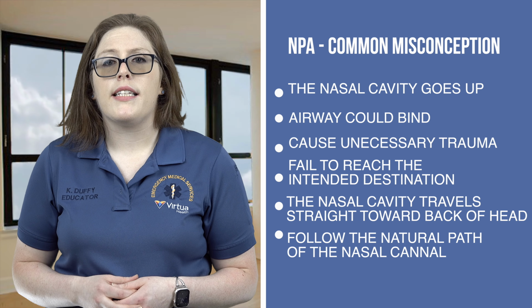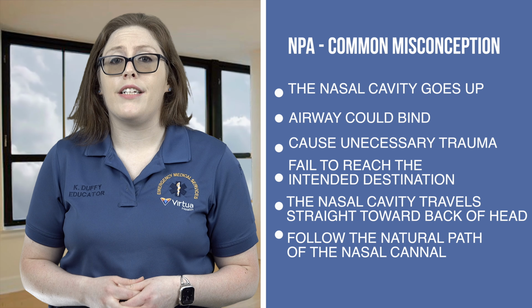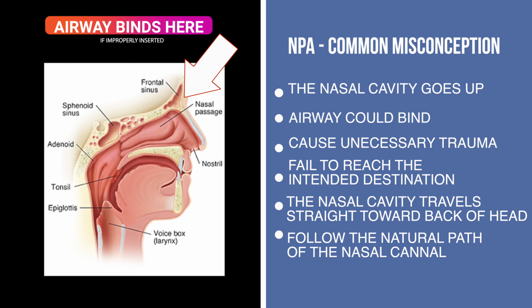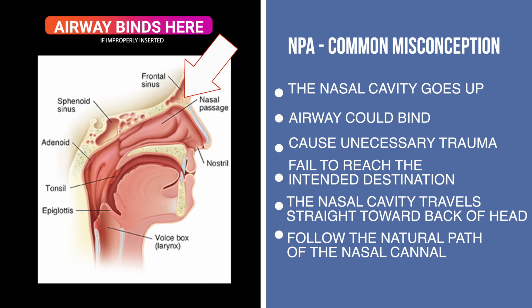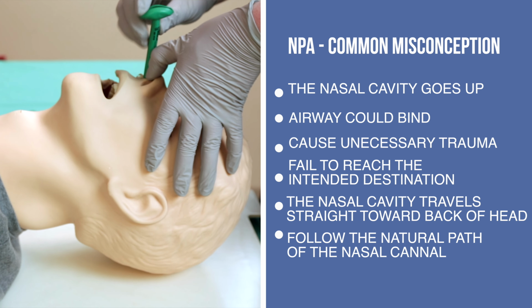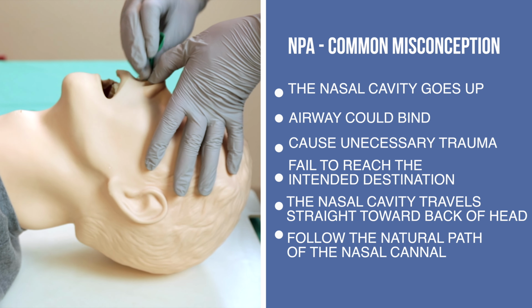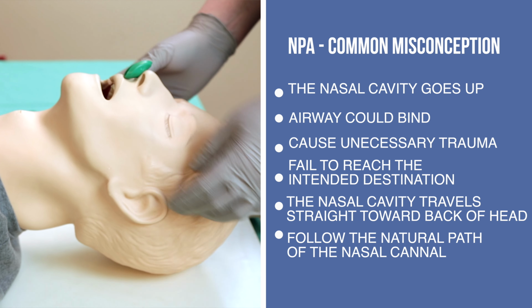A common misconception is the nasal cavity travels in a cephalad or toward the head direction. You can see from the image that if introduced improperly, the airway could bind, cause trauma, or fail to reach its intended destination. Introduce nasal airways straight forward to the back of the head. Following the natural path of the nasal cavity, the airway will rest correctly.